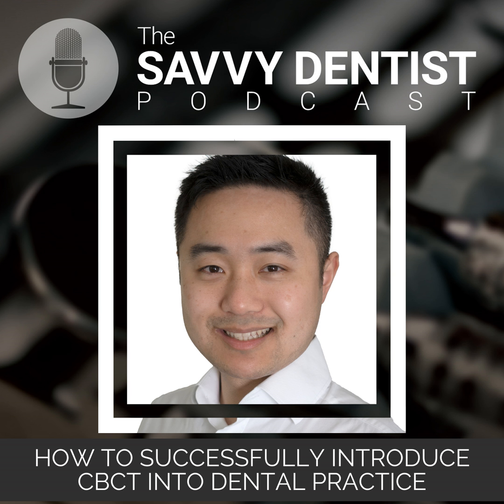So there's a lot of vendors out there, different manufacturers, and all of them obviously are going to say their machine is the best, right? So it's going to be a minefield of information that they will bombard you with. So speaking to my dental colleagues who own CBCTs and have gone through that process, I think they've given some real good wisdom. One, I think the most important thing is you just want to make sure that the machine will actually fit in your real estate. Because everybody might have different sizes of dental room. Just make sure the machine will fit first, right? That's the first thing.